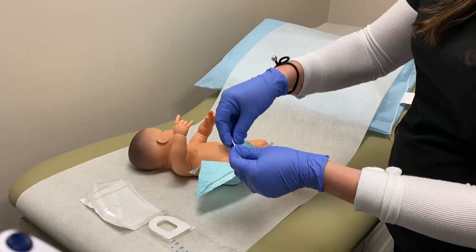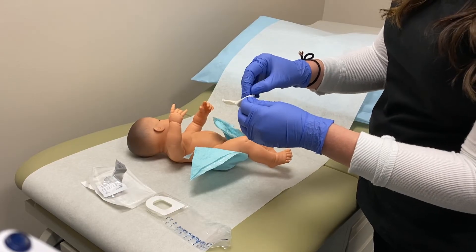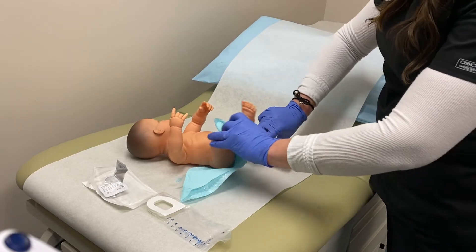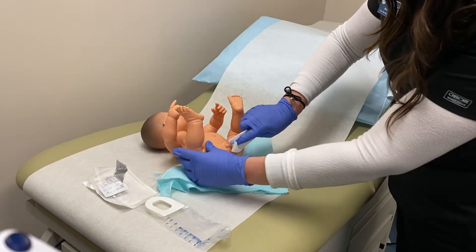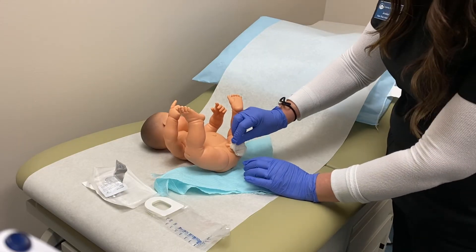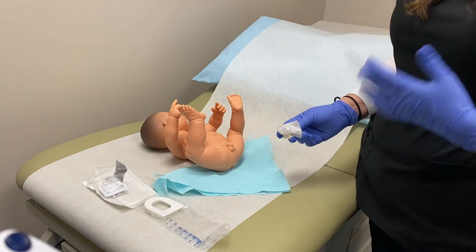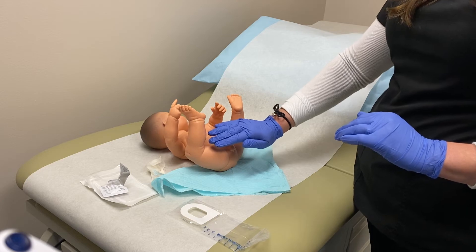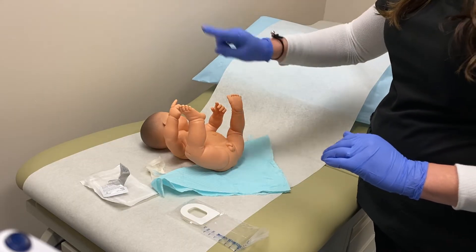The first thing you're going to do is take the moist towelette that comes with the kit — sometimes it comes with it, sometimes it doesn't — and you are going to cleanse the baby. I'm going to put his legs up so it's easier to get to. With little boy babies, you want to make sure that you go around their urethral opening. If they have foreskin, you may need to push that back and clean that. Take your little towelette and just wipe once around. If you need additional towelettes, get those and make sure the baby is clean. If it's a little girl, you are going to wipe once front to back with each towelette — sometimes you need to do that two or three times with separate individual towelettes.